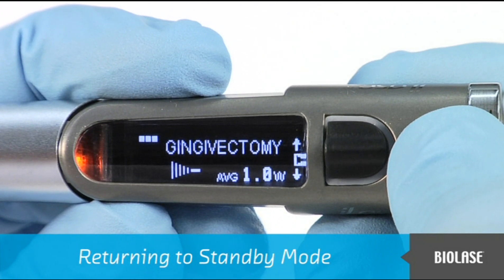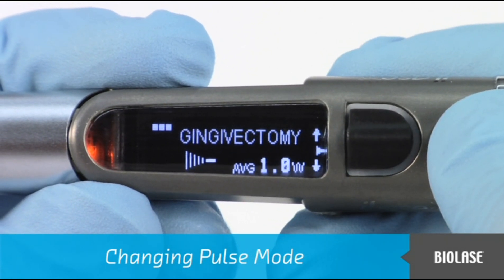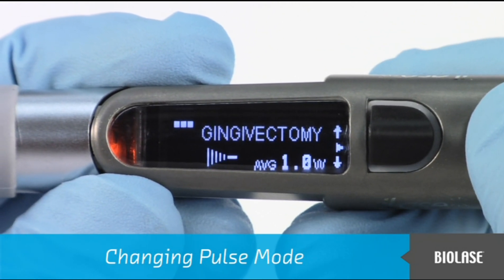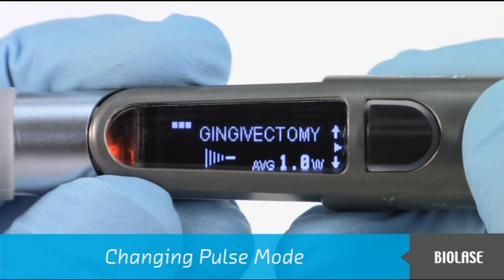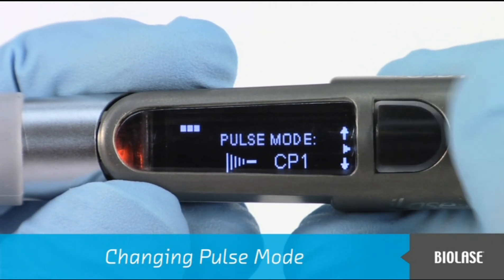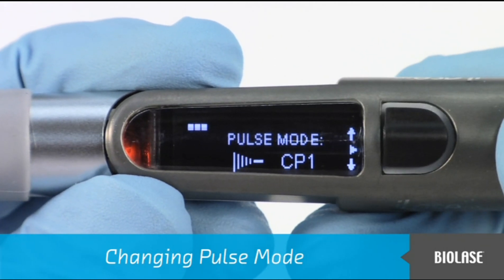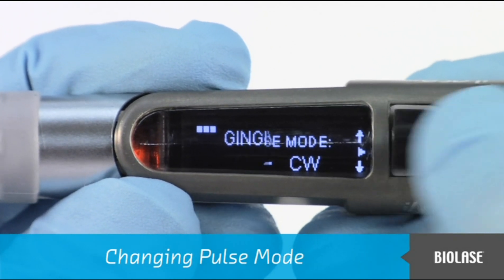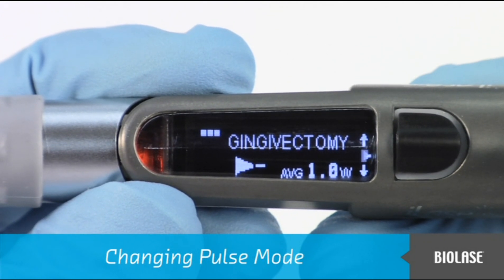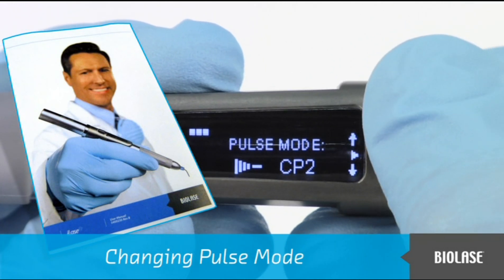To change pulse mode, first enter standby mode. Then push the black navigation button up or down until the pulse mode icon is highlighted, and press the navigation button in. The pulse mode screen appears, and pushing the navigation button up or down will present the three different pulse modes. Press the navigation button in to make your choice. To continue with laser activation, be sure to place the iLaze into ready mode. For more information about the different pulse modes, please refer to your user manual.